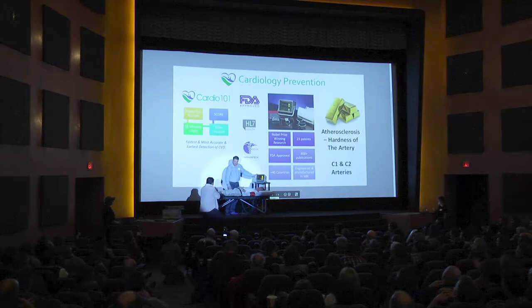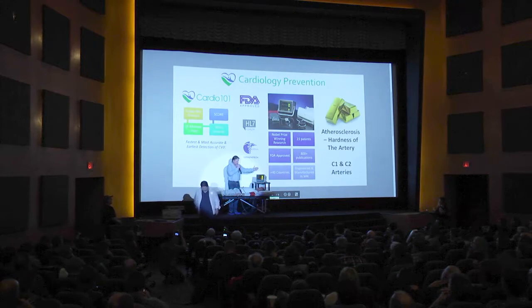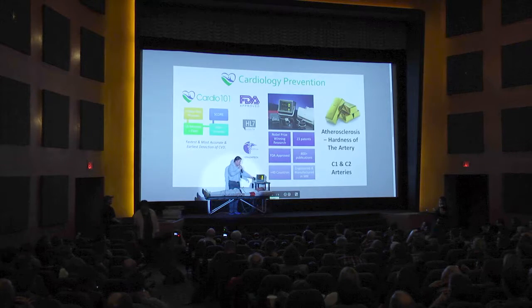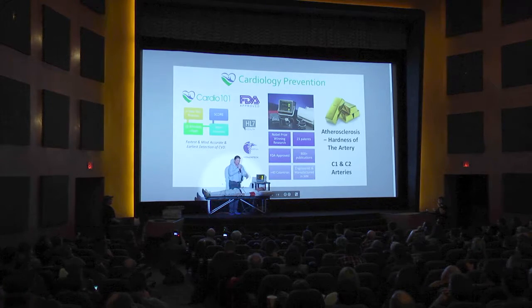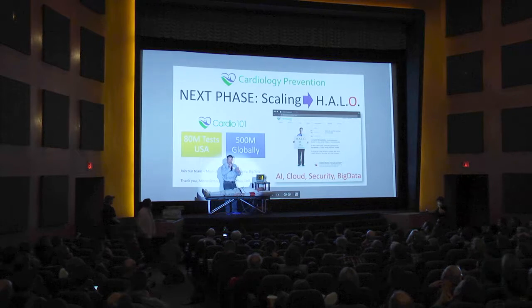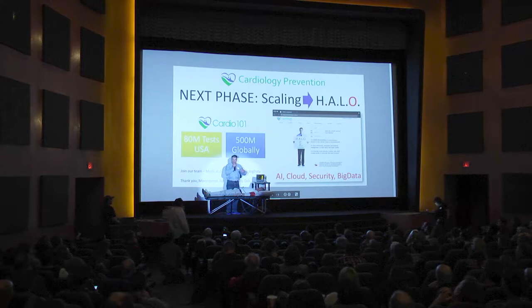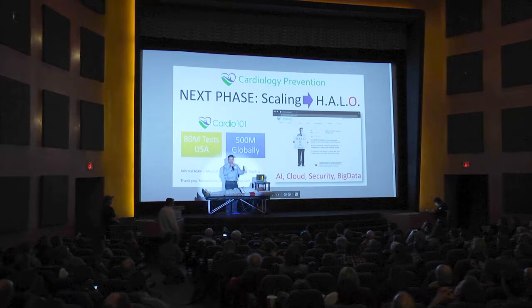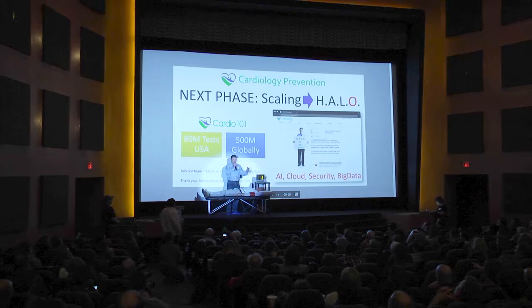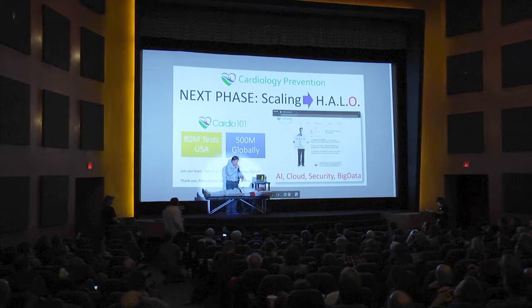Okay. All right. So we got all those results back. Now there's C1, which is your large arteries. We have a C2, which is going to be your small arteries. We get indices for both of those. And based on his age, height, weight, gender, we can determine the level of cardiovascular disease if there's any there. And that's all based on the elasticity of your vessels. The first sign of cardiovascular disease is when you start hardening your vessels. And we want to try to get ahead of that game so we can pretty much discount or relay that, you know, Mike here will now have a heart attack or a stroke in the future.